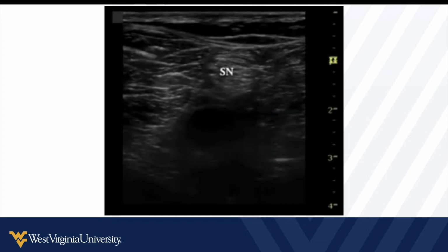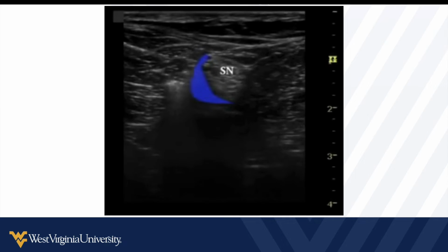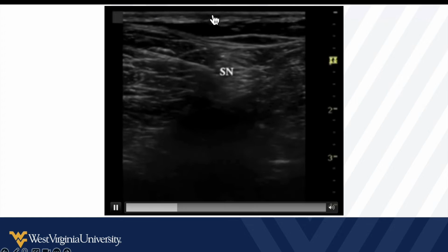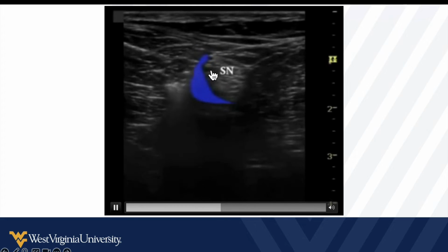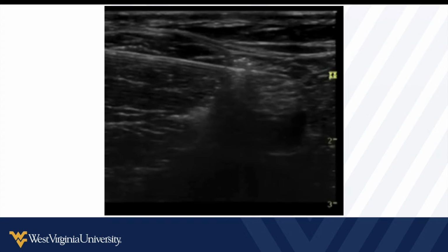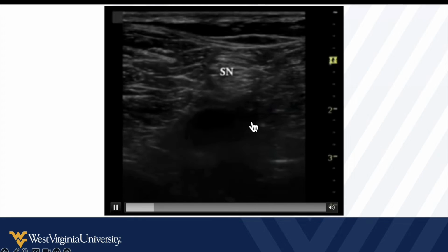And so I'm just going to show you a quick overview. This is one specific procedure, but the overall technique is similar across different anatomical subsections. So what we see here in this case, we've identified the nerve. Here it's the sciatic nerve near the popliteal fossa, and we've brought the needle down. We're injecting. We're going to try to surround this nerve with local anesthetic in hopes of encouraging a nice, complete, and full nerve block for whatever this patient's got wrong. So there's the nerve there. We're trying to surround it with local anesthetic.